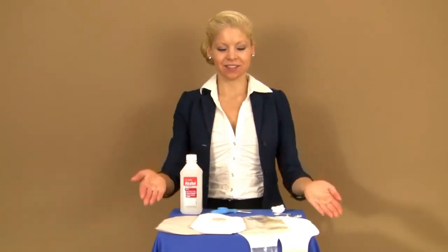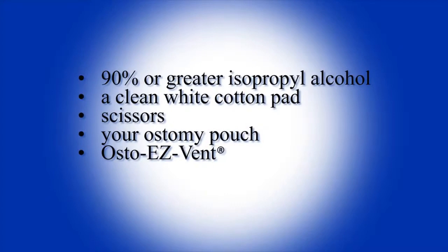To begin, gather the following items: 90% or greater isopropyl alcohol, a clean white cotton pad making sure it isn't a pre-packaged pre-moistened pad, a pair of scissors, your ostomy pouch, and the OstoEasy Vent.